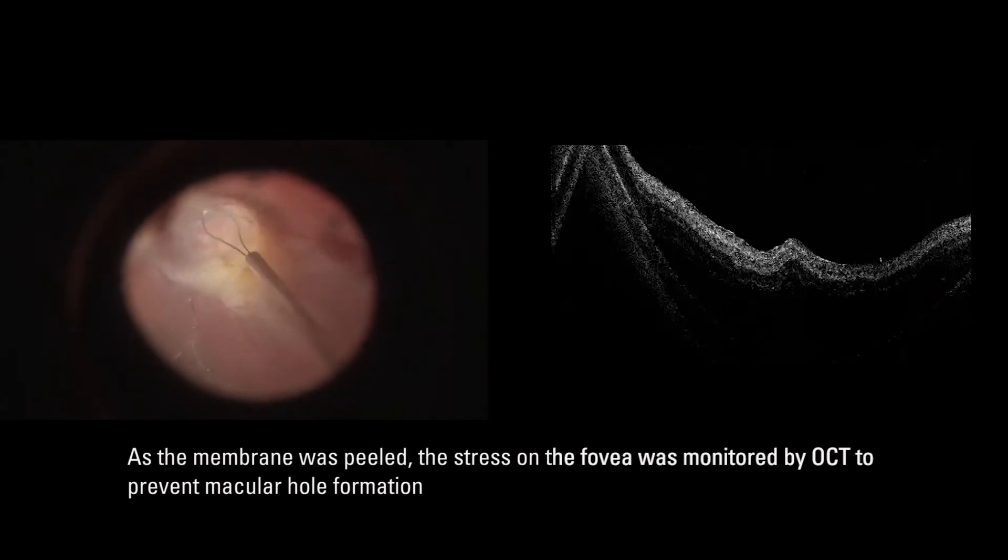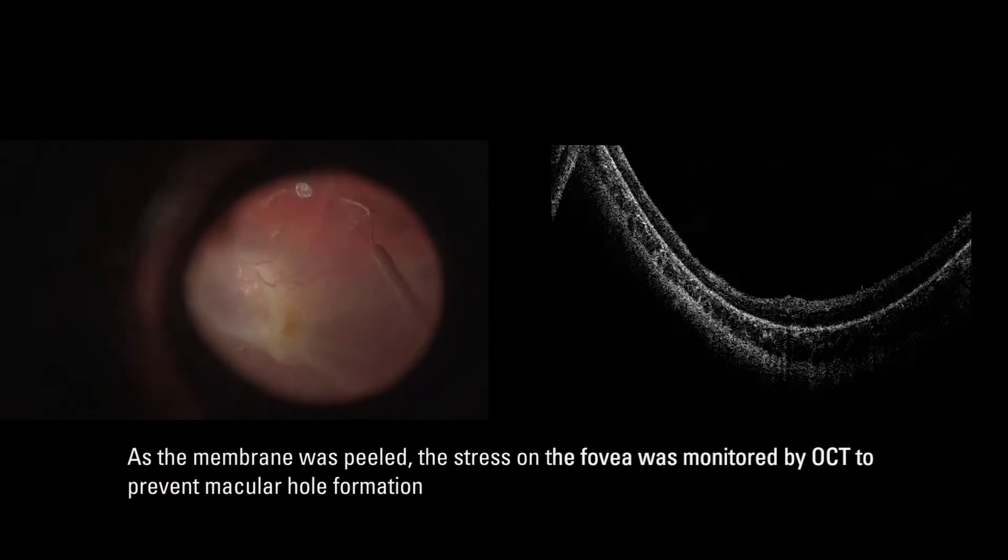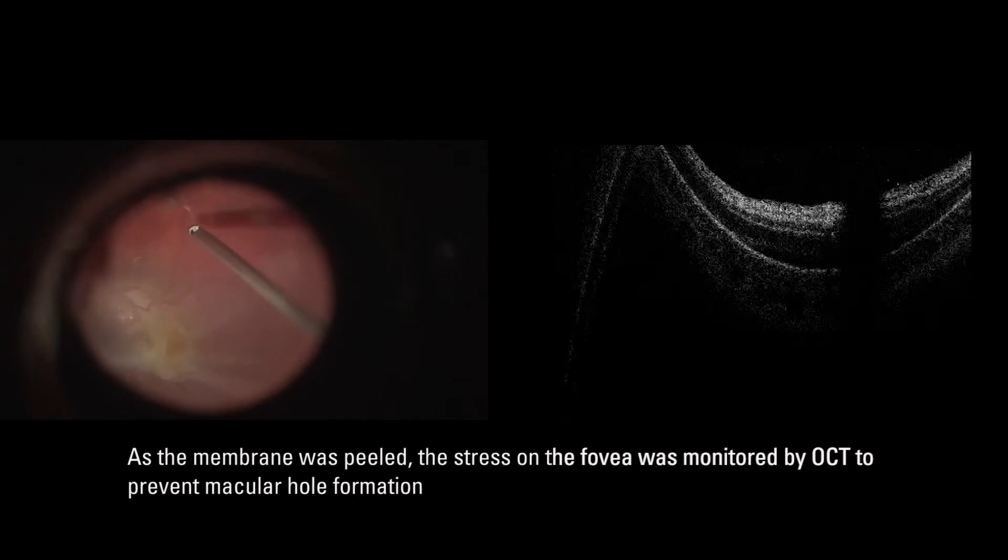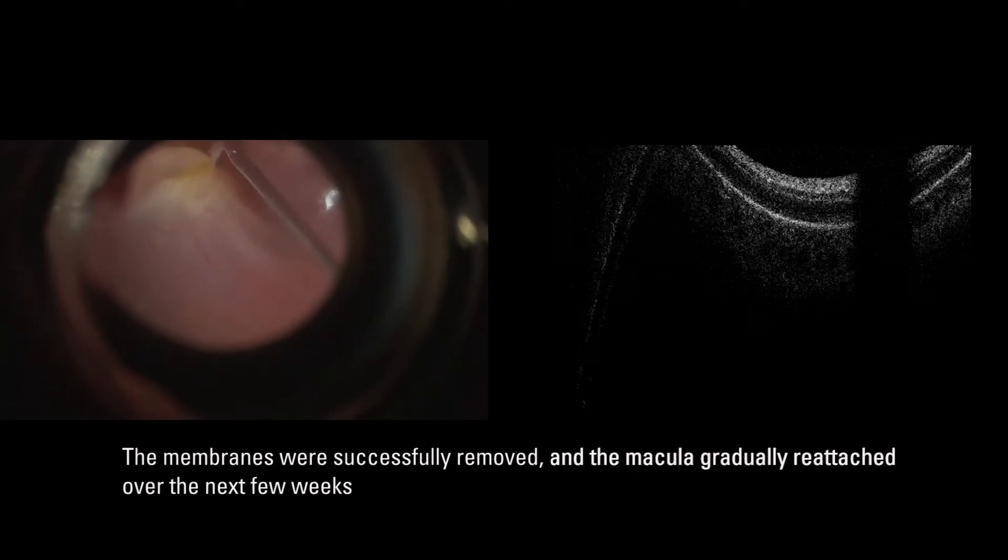Intraoperative OCT was utilized to identify tractional forces in multiple planes, demonstrate retained posterior hyaloid and epiretinal membranes, and to monitor foveal integrity during membrane peeling.